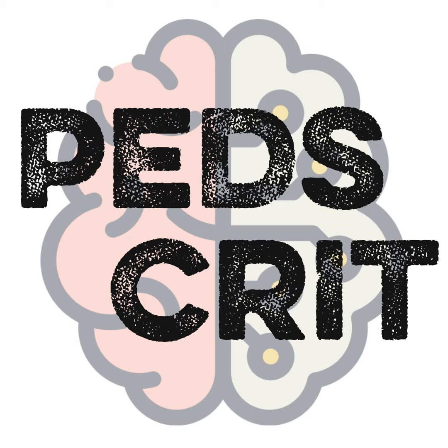As you would see clinically, the patient can have frothy, bloody secretions that you can see through the endotracheal tube. You can see evidence of this in your chest X-ray. The other thing I did not mention is this slow LV distension can also increase your LV end diastolic volume and your pressure. And this can also lead to myocardial wall stress and sometimes even some ischemia. Again, there is stasis and there is not a lot of ejection. This is a prime nidus for an LV thrombus formation and then can have embolic events too.